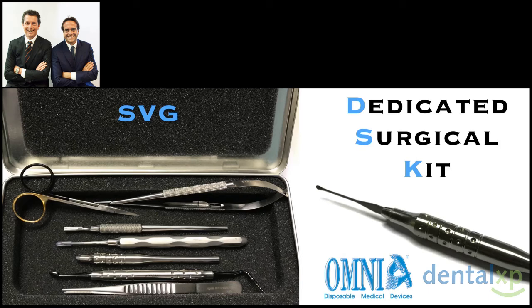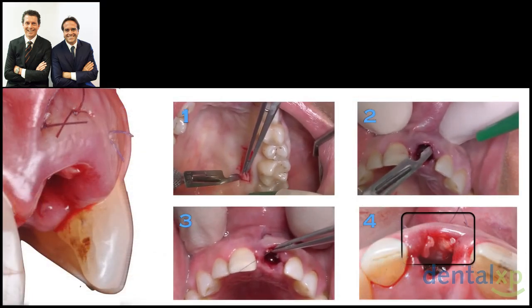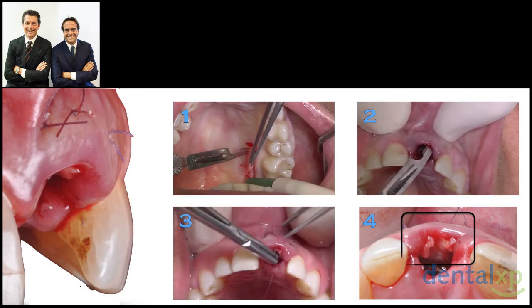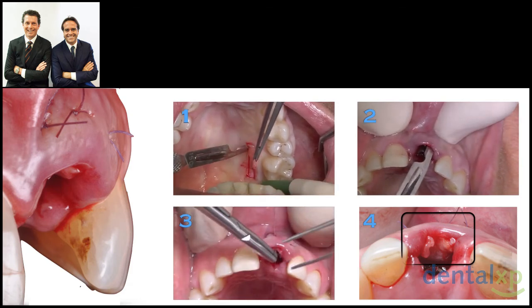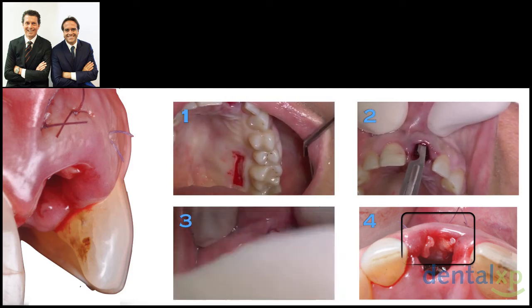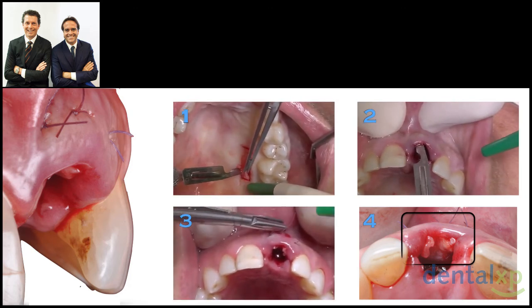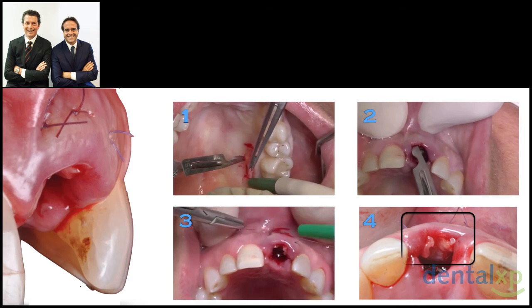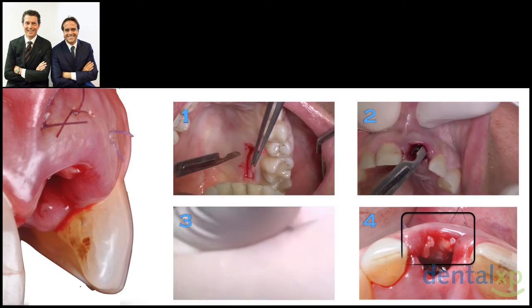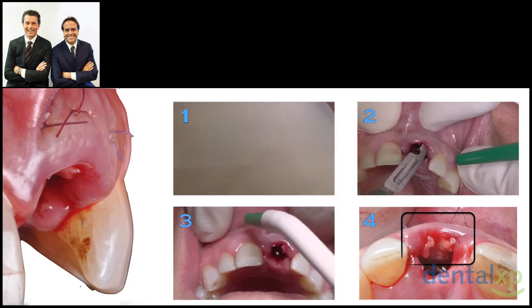And how can we utilize this kit with these specific blades? As described by Professor Zucchelli, an epithelial connective tissue graft is harvested using a 15C blade or a minimal spoon blade, 2 millimeters apical to the palatal gingival margin of the second bicuspid and the first molar. Note that the first incision is horizontal, then the 2 verticals, and before the last horizontal incision, I prepare the graft, avoiding too much bleeding in the surgical area and leaving the submucosa to protect the bone. So, which are the key words for this phase?